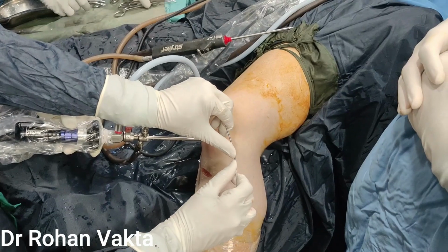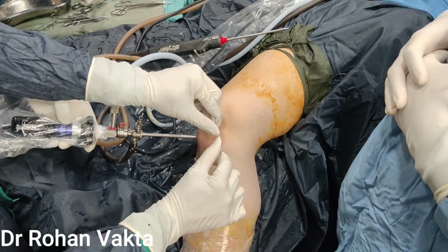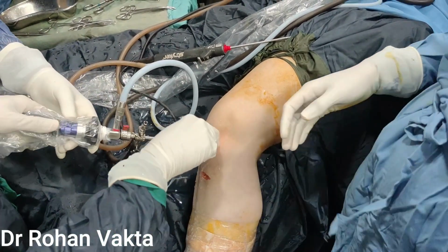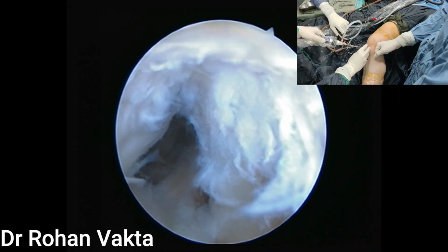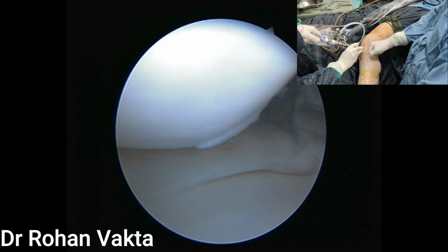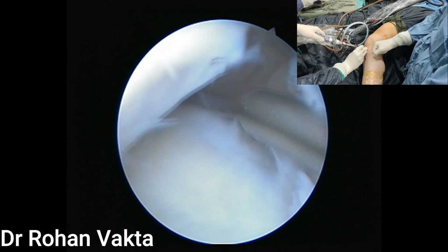Take a single lumen cannula for inside-out meniscus repair. You can bend it a little bit. Put your scope through the medial portal and the cannula through the anterolateral portal, so that it can get a proper trajectory between the medial femoral condyle and the PCL.